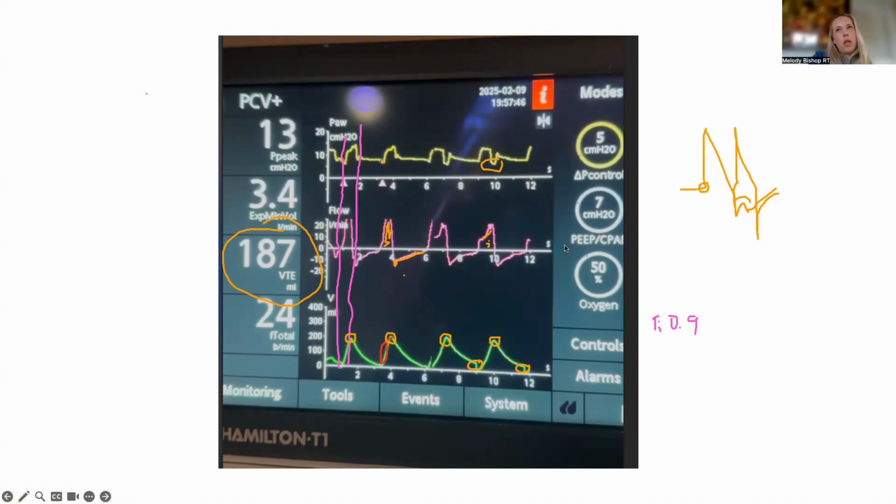Exactly. One really good way, if the reverse trigger is sedation based, to navigate through whether that's what you're dealing with is to throw your patient into pressure support. I like to use the analogy for sedation based reverse triggers, this poke and breathe analogy. If you had someone with heavy sedation, you're trying to get them to breathe on their own, you can shake the patient, hey, Bobby, take a big breath in, I just chose the name Bobby randomly. And then they'll breathe, right? Because you're stimulating them.